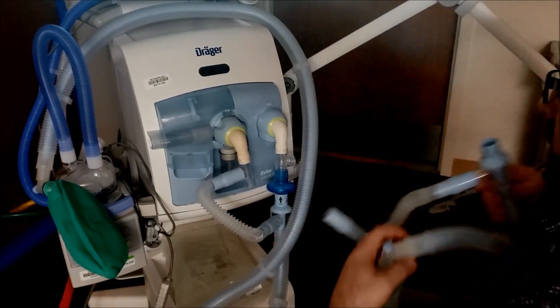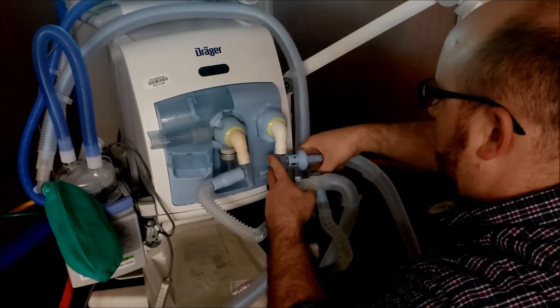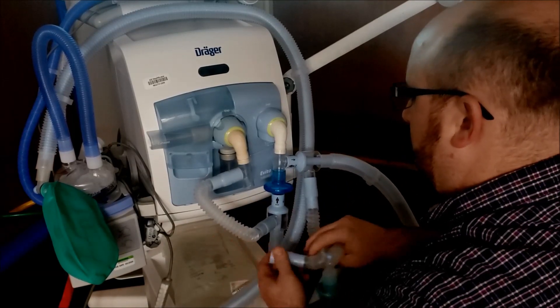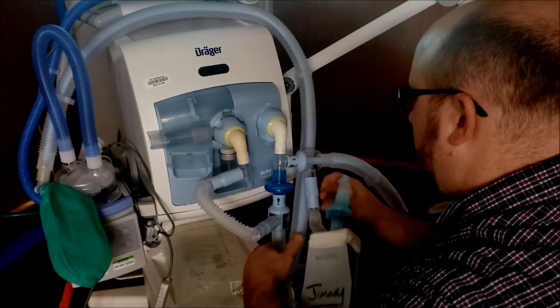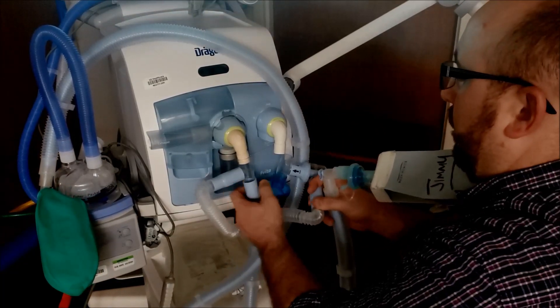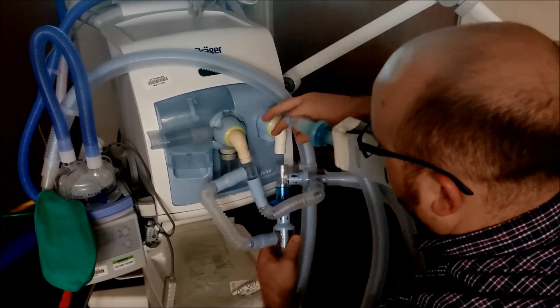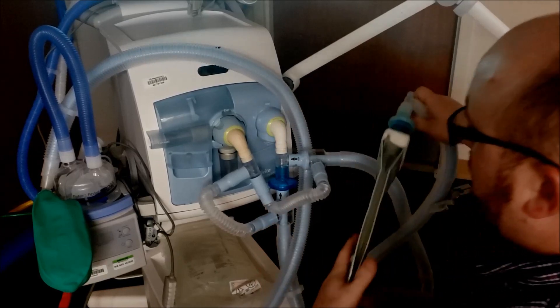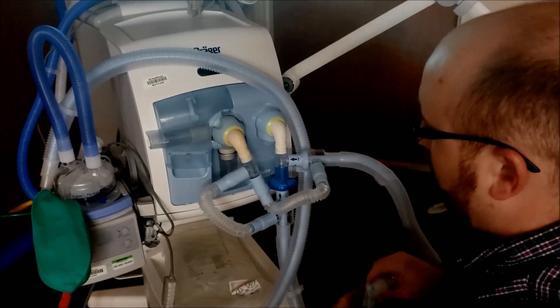Second circuit goes right here. Attach there on the inspiratory side and attach right here for the expiratory side. Run it out the front. And there we go. So now we have two going in the inspiratory and two going in the expiratory.